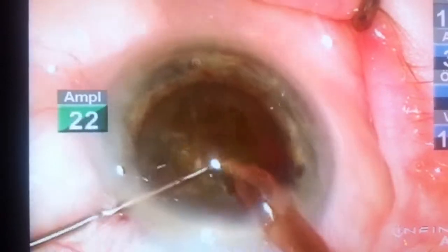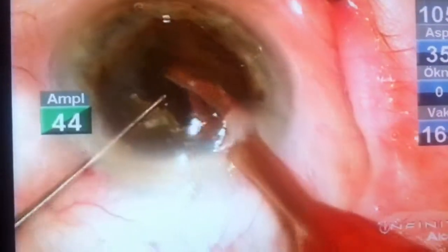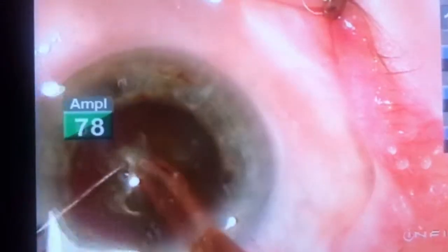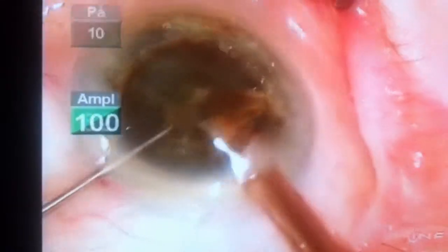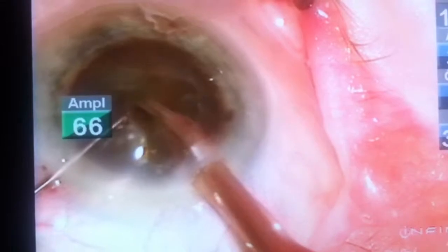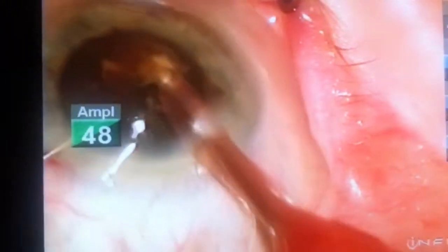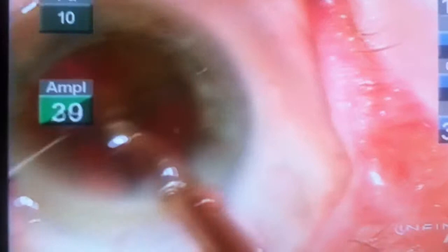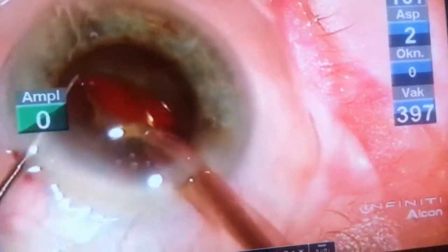The first strategy is to remove the first small quadrant to win some space, which will help you move the hard fragments within the capsular bag and reduce the zonular stress. It is always recommended to keep the phaco tip central — all manipulation is done with the second hand. The phaco tip is placed centrally for the best possible anterior chamber stability, reducing phaco energy damage to other intraocular structures. Keep it at the supracapsular level, dealing with fragments one by one.